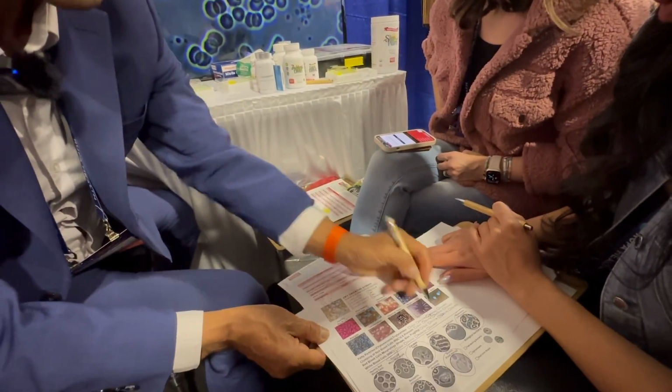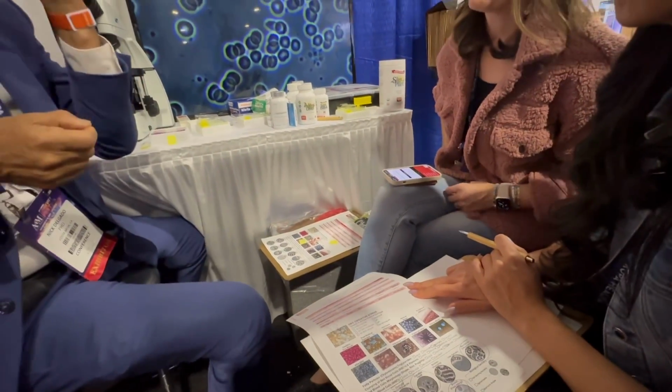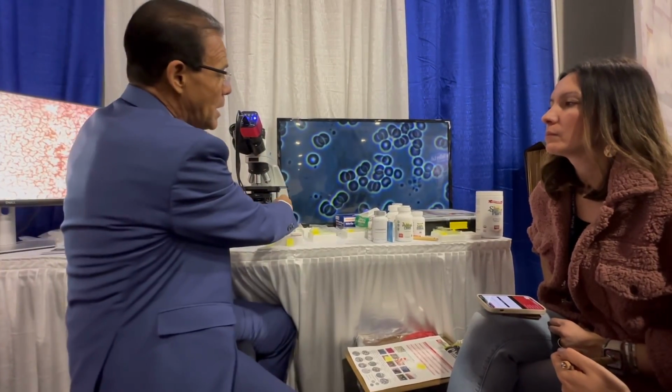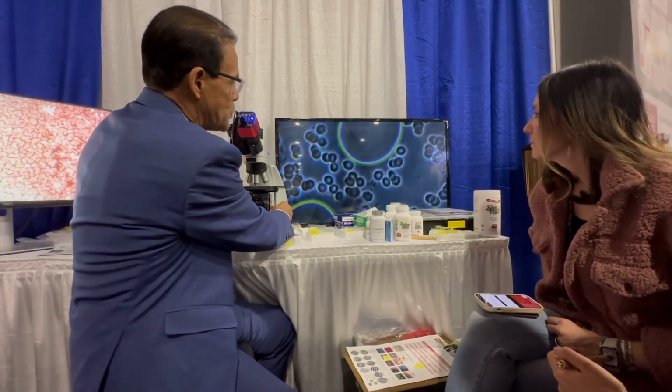Now, we have a cholesterol machine at the office, we put it in a machine. In 5 minutes, we measure the triglycerides, cholesterol, and then we compare that to the visual. Then we can definitively say that is clumping when the triglycerides get over 250. It's too much fat in the blood. So you got to modify your diet, make sure you're getting exercise, reduce your sugar intake, all those things that people need to know, which is another reason why this is a great tool.